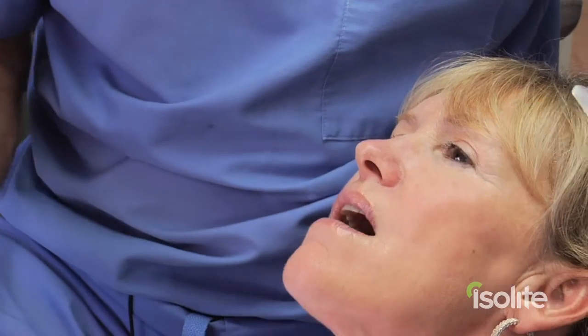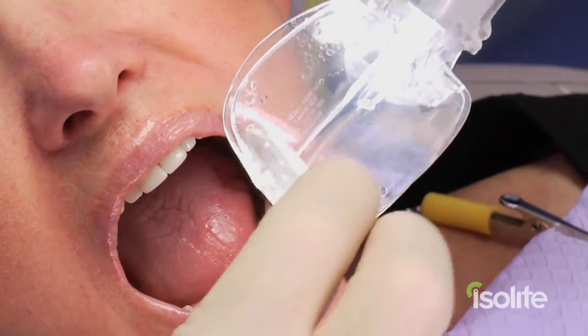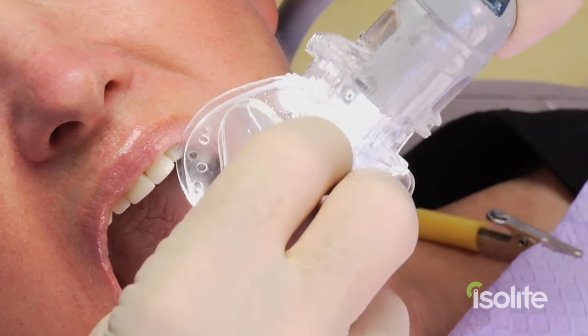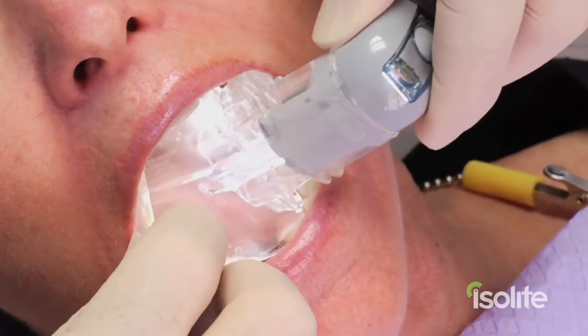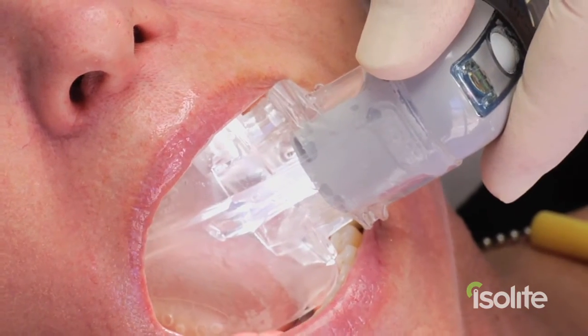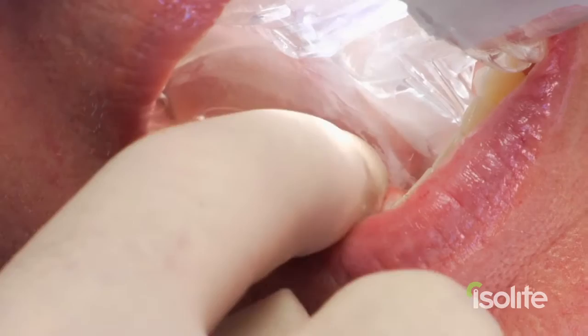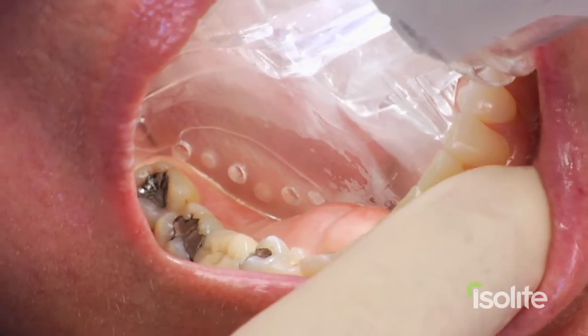I've lubricated her lips with Vaseline and moistened the back side of the Isolite with some water. I'm taking the whale's tail and folding it up towards the cheek protector, and now very gently inserting this into the cheek. Notice that the bite block is now pulled back across and resting just distal to the cuspids. I tuck in the Isolite, making sure it's not resting on the torii.